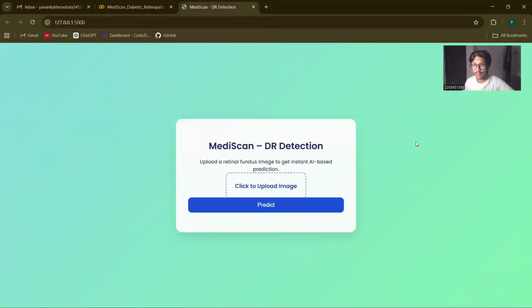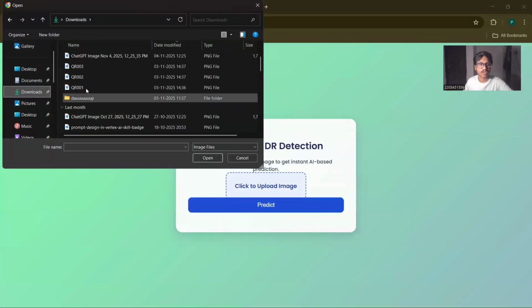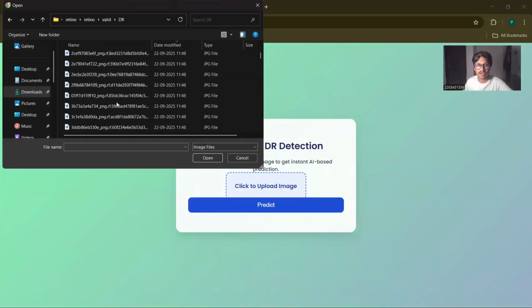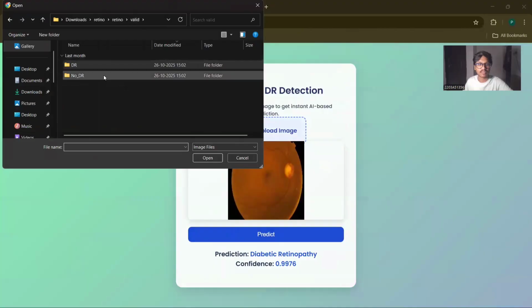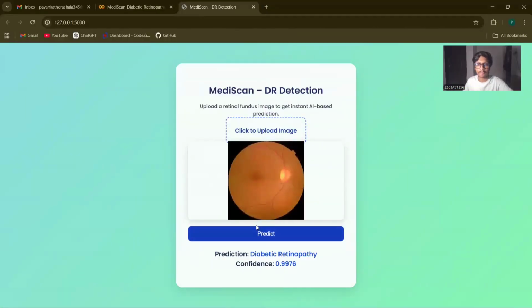So this is the final web page. We created it very simple and minimalistic. And here we can upload an image. So I'm uploading an image from our data set, an image which is already infected by diabetic retinopathy. When I click predict, it shows the prediction is diabetic retinopathy and the confidence is 99%. At the same time, I'll add one more image, which is a normal eye, not infected by diabetic retinopathy. And here it shows the prediction is normal and the confidence is 98%.